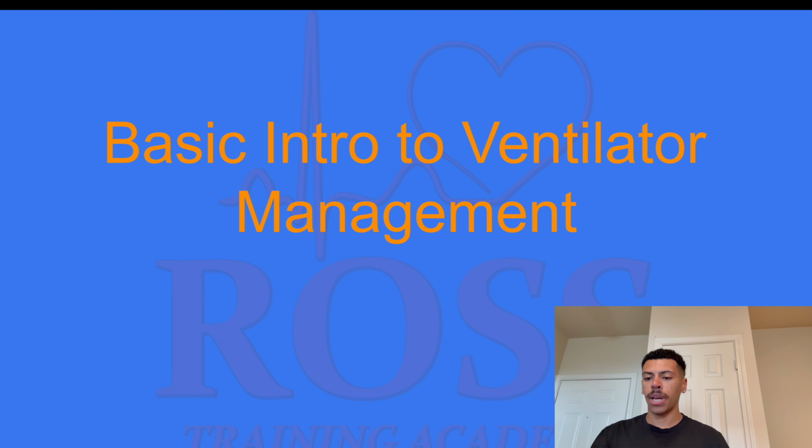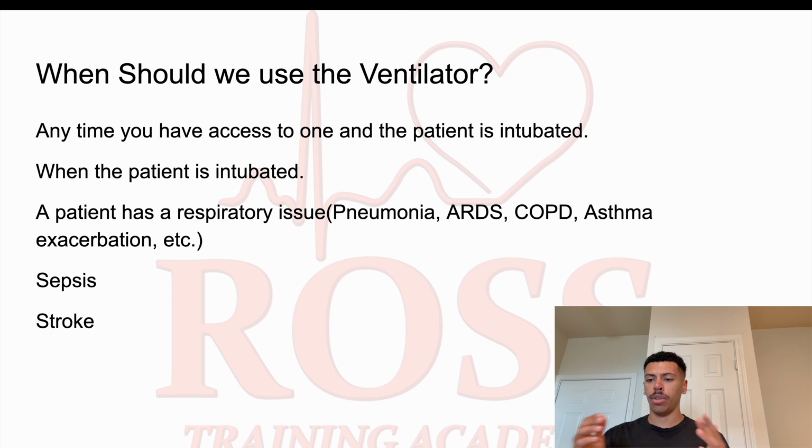All right, so we're going to go ahead and start looking at basic ventilator management. So when should you use a ventilator? You're going to start using a ventilator whenever the patient's intubated, whenever you would use a BVM, and then some other examples, some things like pneumonia, ARDS, COPD, asthma exacerbation, more so when a patient's having a severe respiratory complaint that they aren't able to manage by themselves, that you've been trying everything that you can up to this point to manage, and it's just not really working out.